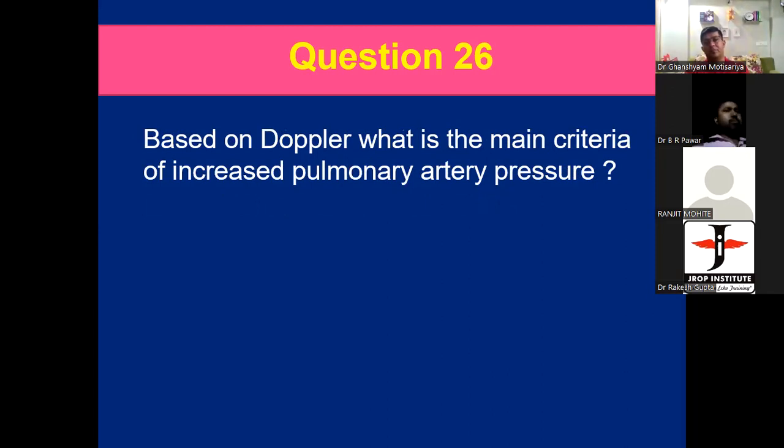TR jet velocity, man. TR jet velocity. Is that right, Krishna Yadav? Are you still there, Krishna? Yes, sir. What did sir tell you? He gave you the answer. What is the answer? TR jet velocity. From that, what will you measure in the TR jet?